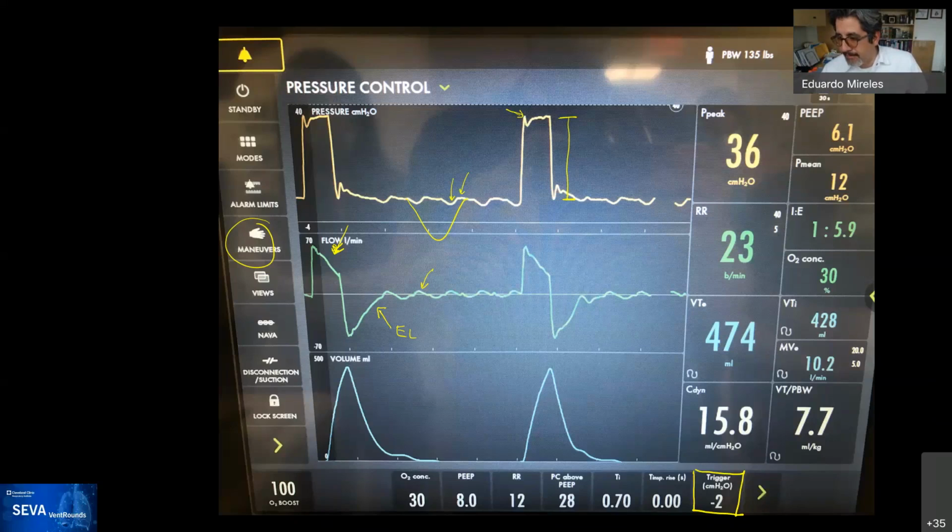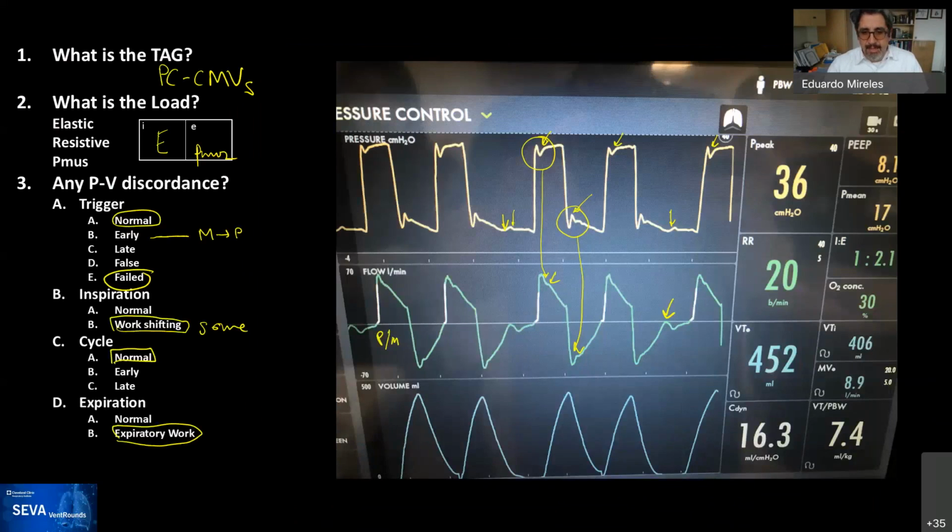Excellent job. Great job, Marina. Great job, Udi, reading this. Thank you, Mike, for sharing this case. I would not have picked it up, I can tell you that. This was very, very interesting.